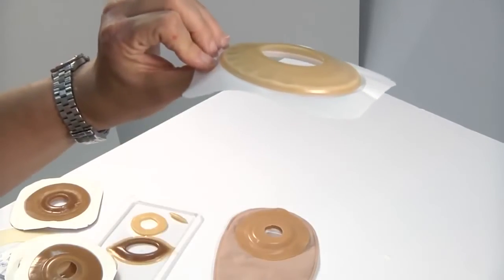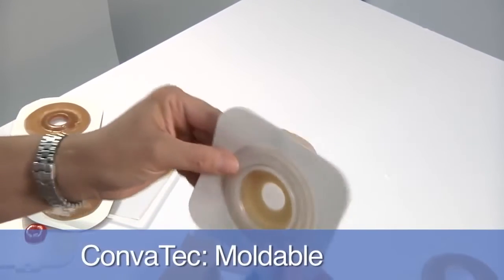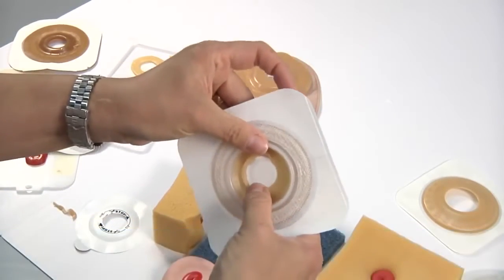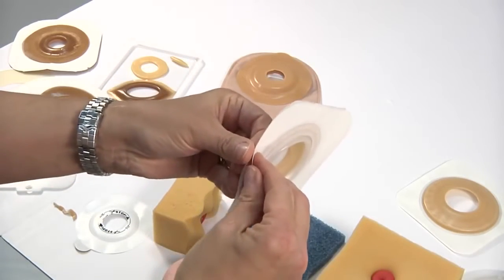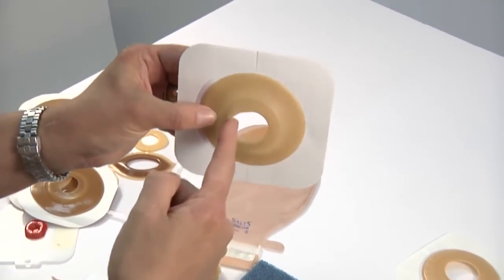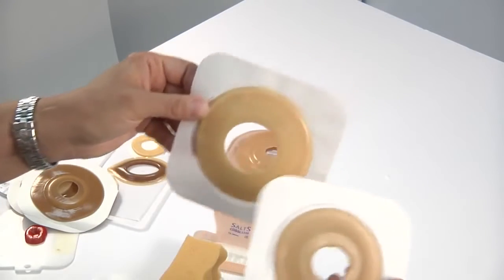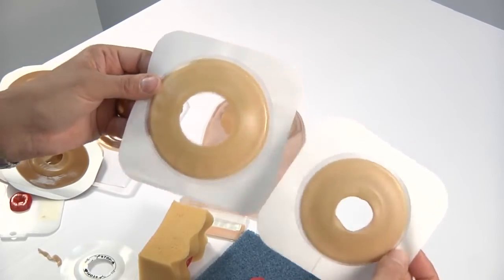You can see that there's quite a bit of a slope to it, as opposed to this one, which is their moldable version. And this one, you can see there's a slope as well, but you're actually shaping the inner barrier. This one you don't cut. This is their moldable. And again, when you take the backing off of it, you're going to see that this one doesn't actually have any rigidity to it. The rigidity is way out at the periphery here, as opposed to this one where the rigidity is right here, right at the opening edge. So you have to, again, consider what it is that you're hoping that your barrier is going to be able to do for you.